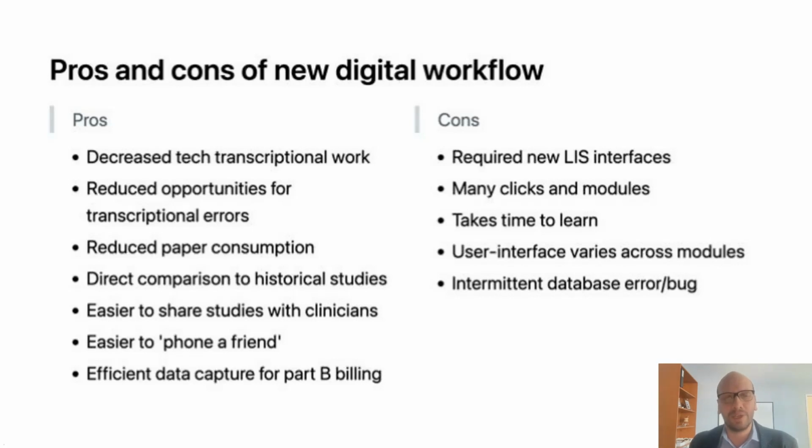Similarly, when we have a very challenging study, we can take a screenshot and consult our colleagues and have other pathologists weigh in on it. Before this digital transition, we either had to take a picture and scan that picture and then share it, or we had to take the physical copy and walk over to our colleague's office. So now we have almost real-time feedback. Hey, what do you think of this study?